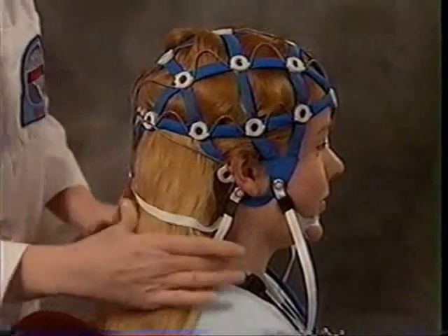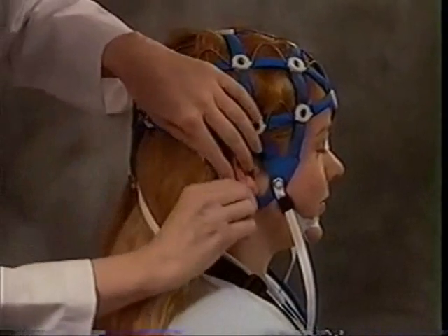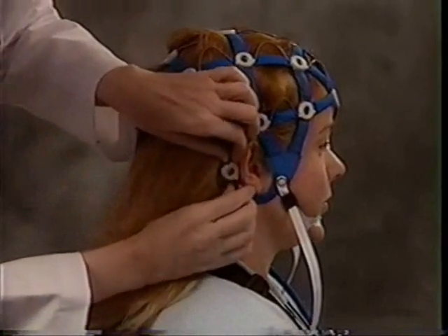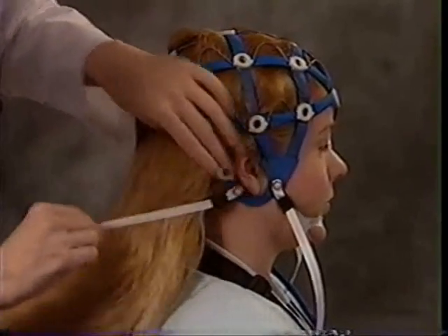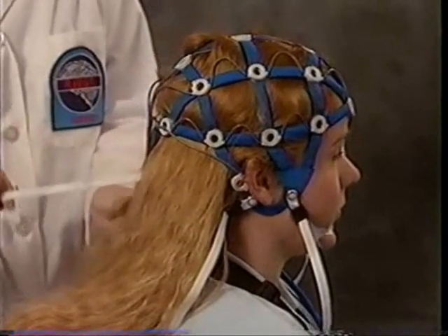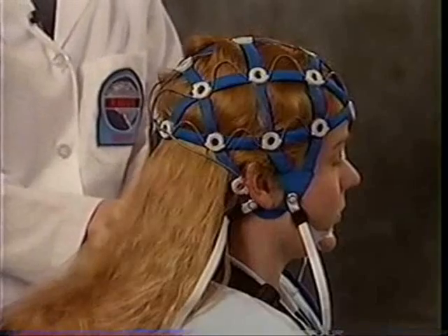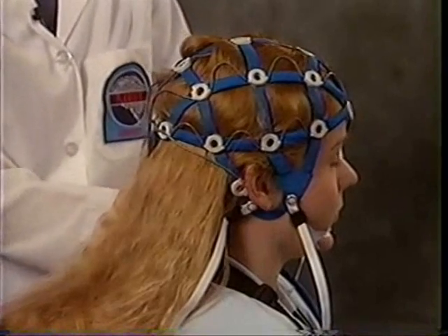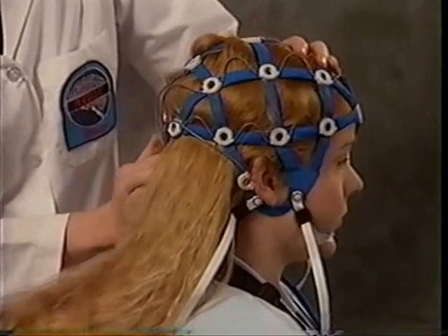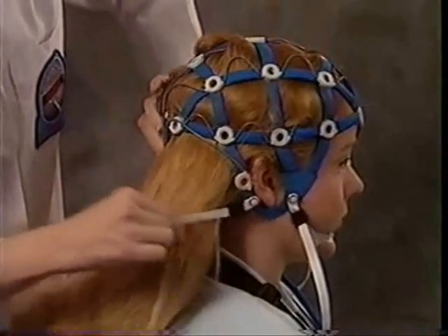Before aligning the inion pull tab, release the neck strap. Loop the hair over it and re-fasten the neck strap. Check and adjust the inion alignment, then tighten the neck strap.